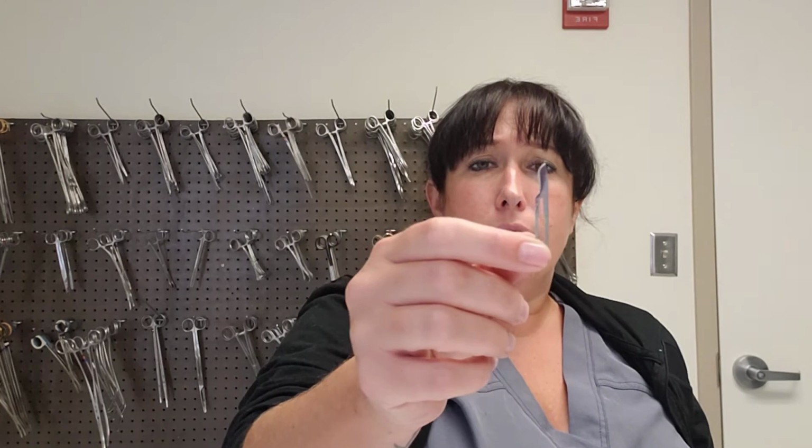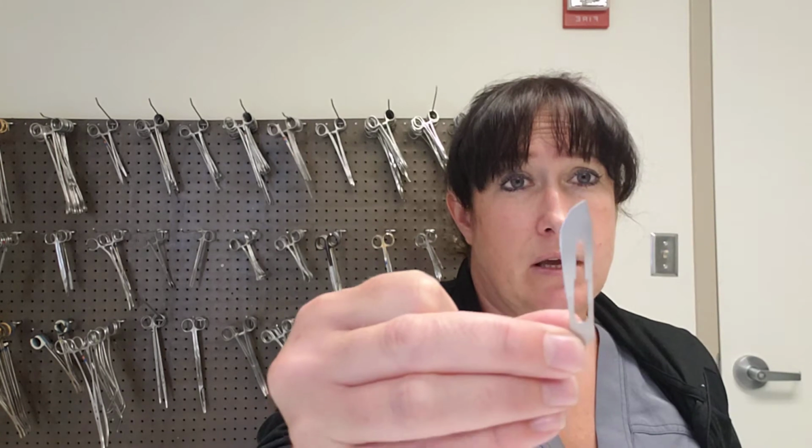But you wouldn't want to use this tiny little blade, right? You'd want to use a bigger blade. Some places even use an even bigger blade, like a 20 blade. But anyways, for smaller incisions, like maybe an inguinal hernia or something on the wrist, they might just start with this 15 to make the incision.